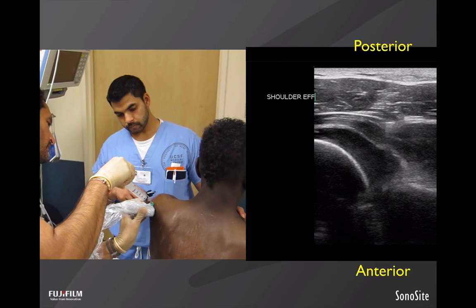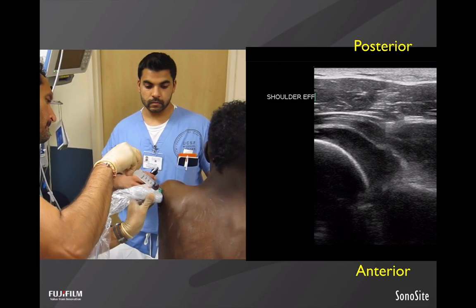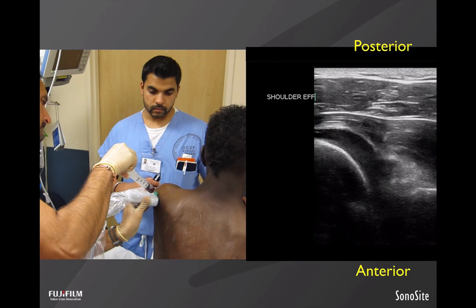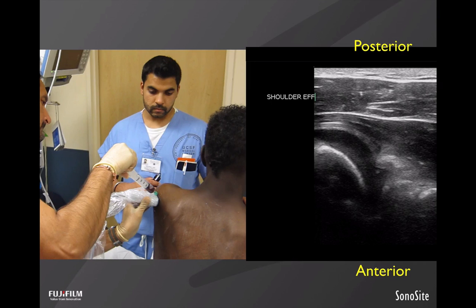This is a patient that I had that needed to get his shoulder aspirated at about 3 in the morning. No other consultation. If you look on the left, I'm aspirating a large amount of hematoma or hemarthrosis from this patient's joint. On the right, the ultrasound image, you can see the needle quickly coming in to that space and obtaining joint fluid, or actually hemarthrosis in this case. The beauty of this procedure is, one, I'm confident where I'm going. Two, I know exactly what I'm looking at. And three, I know that there's actually fluid to aspirate.